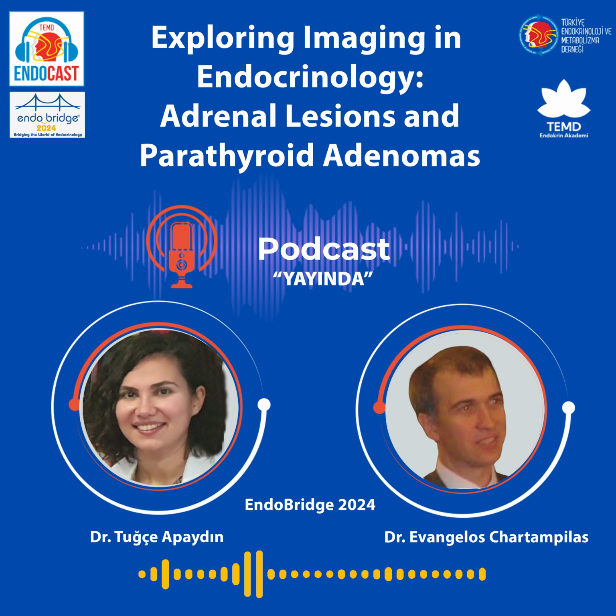On the contrary, lymph nodes, which are your main differential diagnosis because at the location of the adenoma you frequently see lymph nodes, tend to progressively enhance. So you can differentiate between the two. If the lesion washes out, it's an adenoma. If it progressively enhances, it's a lymph node or sometimes an exophytic nodule from the thyroid, which is also a differential. For example, a nodule hanging from the lower pole of the thyroid is still thyroid. Okay, thanks a lot.